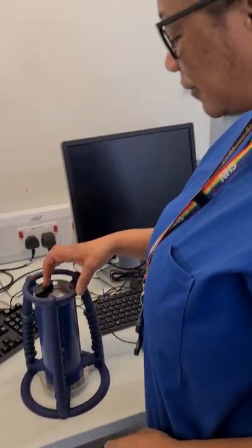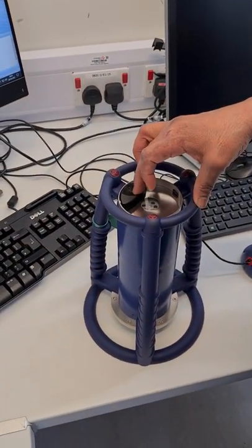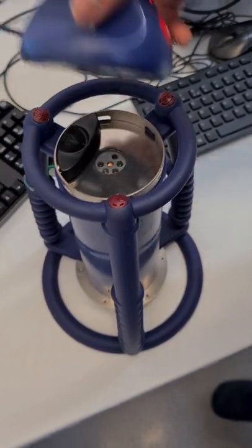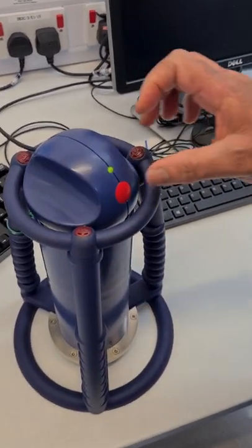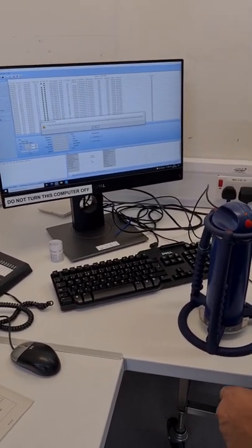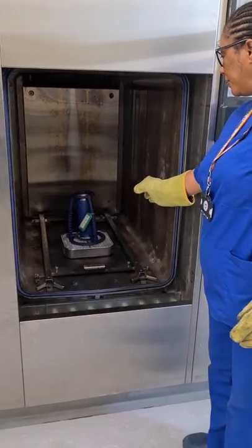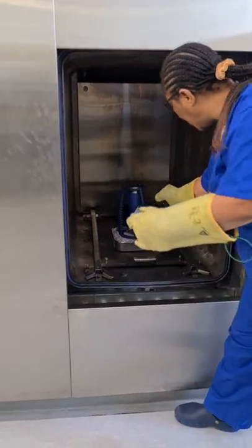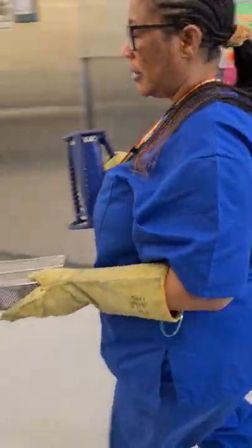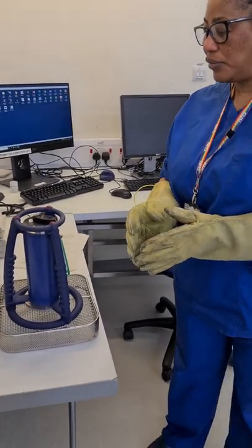After the Bowie-Dick cycle is done, I'm now going to demonstrate how we download the ETS into our system. The ETS now shows the green light, indicating the test is complete. I'm bringing out the ETS now and placing it on the table. I'll leave it to cool for a while before I do the downloading into the system.